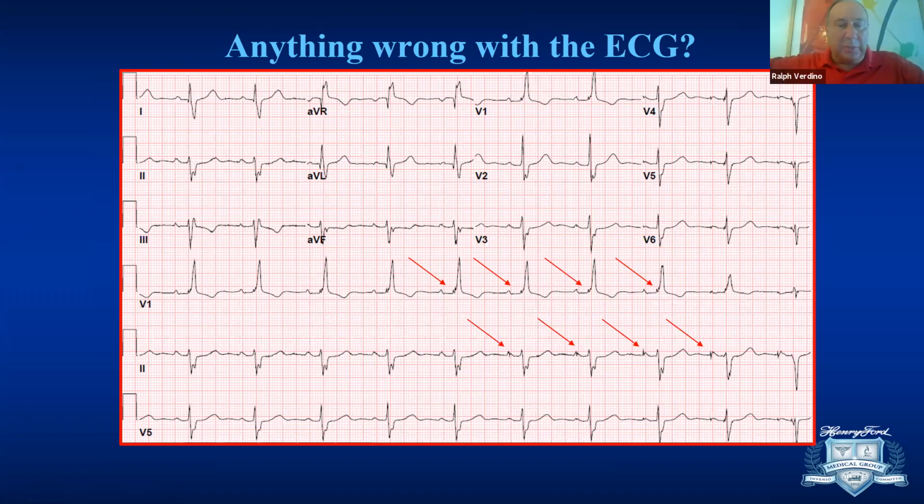And that could also be possible even with the lead. It may be, with the ventricular lead, sometimes, again, especially in a right bundle branch block, imagine that, the lead is almost always in the right ventricle that you use to sense. So in a right bundle branch block, it's actually not that uncommon to have a spike in the QRS, because by the time that the impulse makes its way down the left ventricle and crosses over, it actually may fire, and it may be very similar to AV delay to your PR interval, and it's not uncommon.